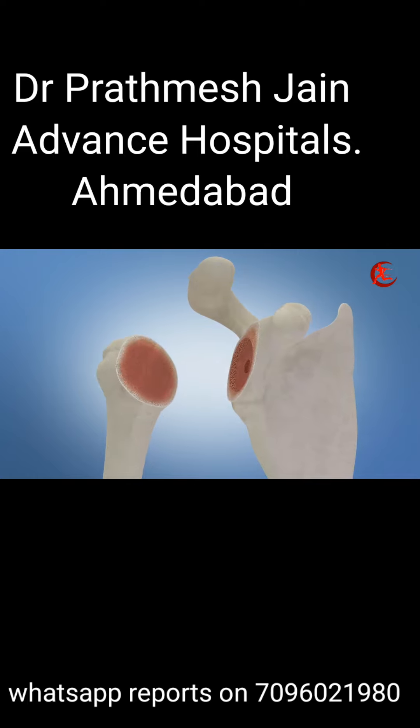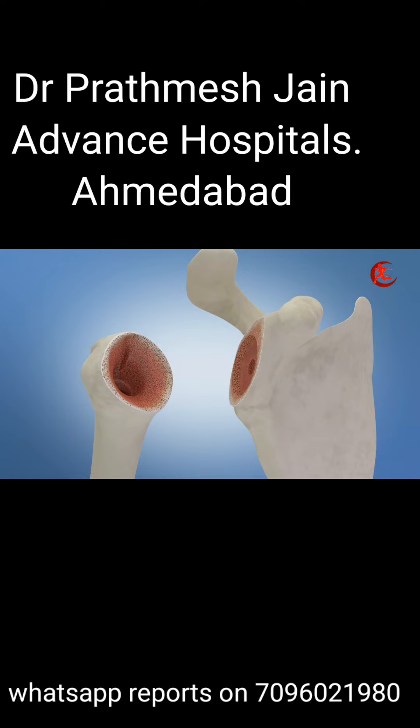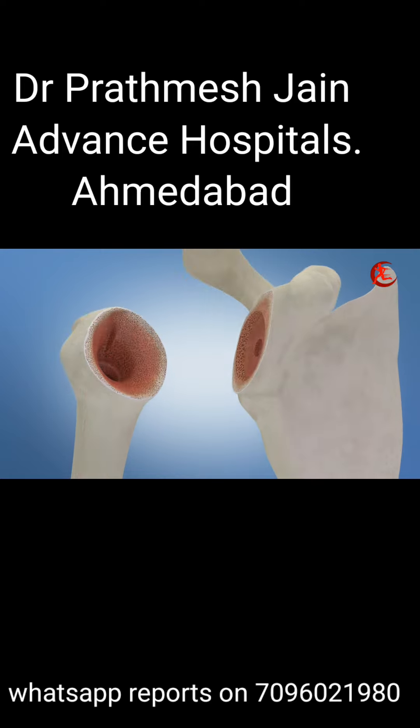The next crucial step involves preparing the humerus. This is done by inserting a set of instruments down the bone's canal to determine the ideal implant size and angle. A portion of the bone is then expertly removed and smoothed to create the perfect foundation for the implant.